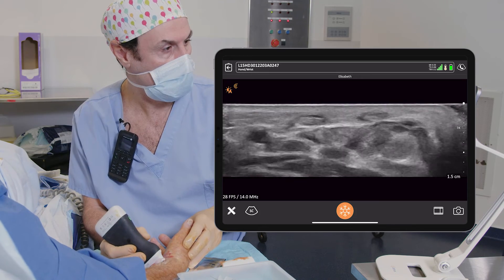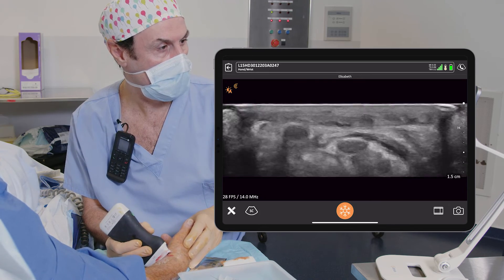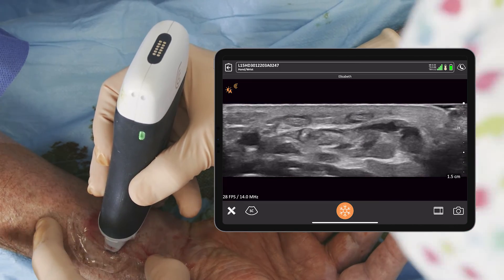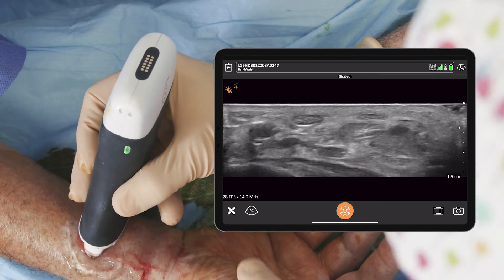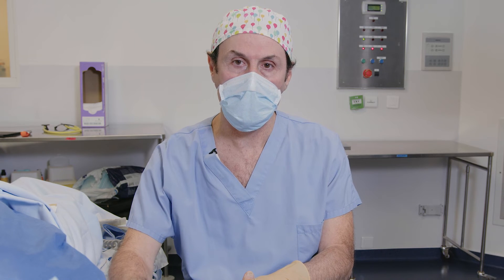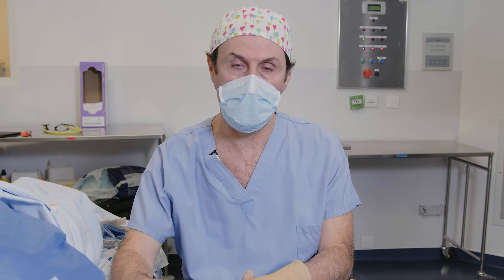We can see the diffusion of local anesthetics five centimeters up after the injection. It's important to do wide awake anesthesia for this patient because he has difficulties walking and he has to use his two hands. So axillary block is not recommended, and we do wide awake anesthesia so he can use his two hands after surgery.